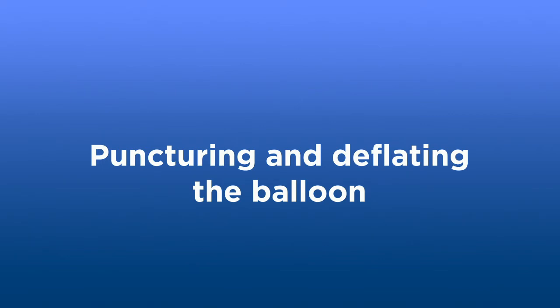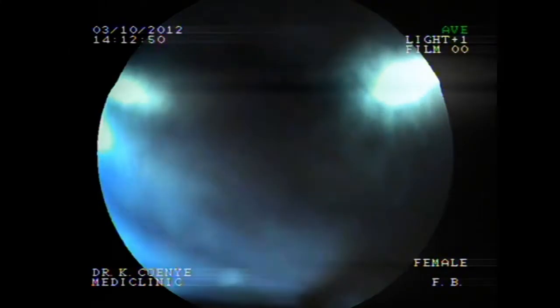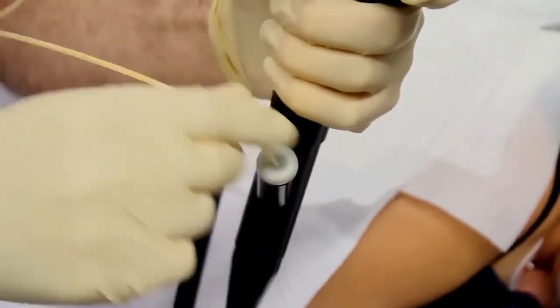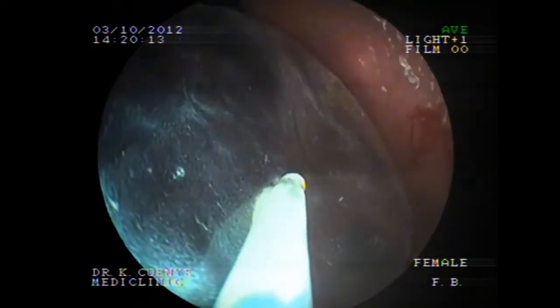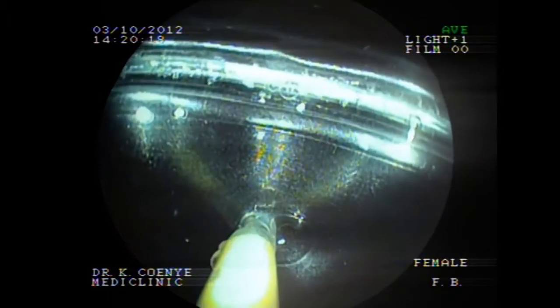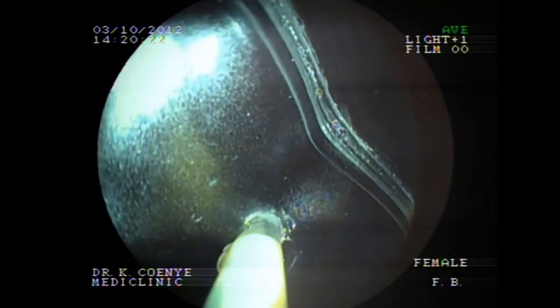Puncturing and deflating the balloon. Using the endoscope, locate the blue valve. Introduce the supplied needle into the operating channel of the endoscope, and then make multiple punctures to the balloon around the blue valve. Do not yet aspirate the air of the balloon. Each time the balloon is punctured, position the catheter of the needle perpendicular to the wall of the balloon, puncture, and then retract the needle. It's better to perform the last puncture in the area adjacent to the blue valve.